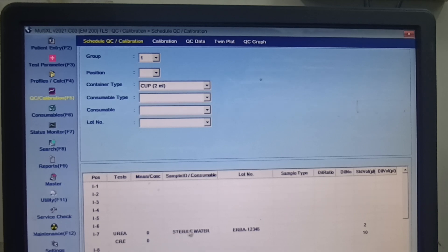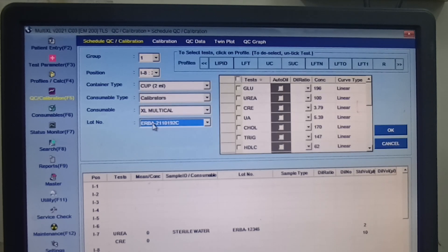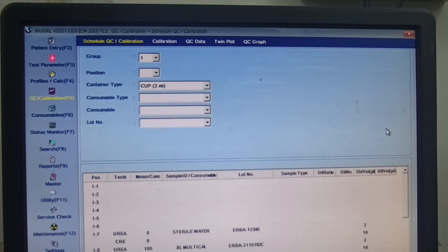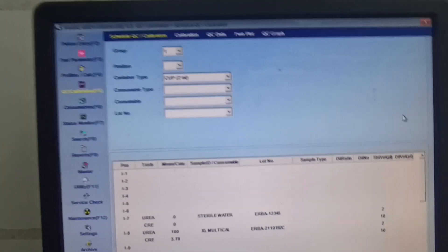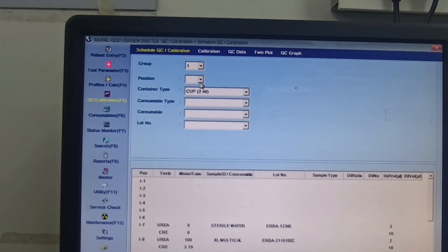After that, press the position and then press I8, which means XL Multical. Press OK, and you also have to select urea and creatinine for calibration. Click OK — urea and creatinine will also be highlighted here.